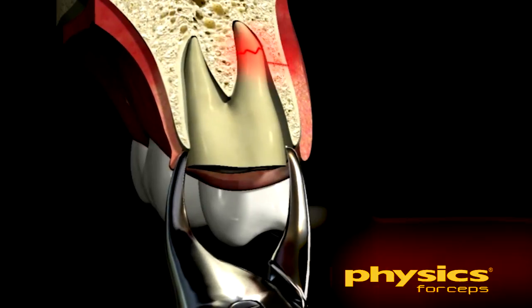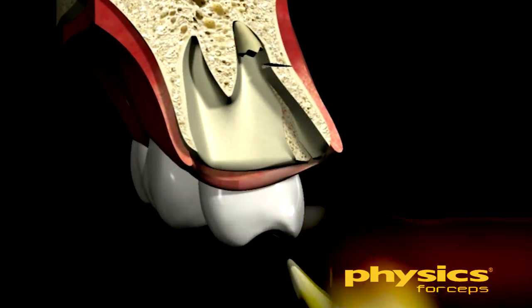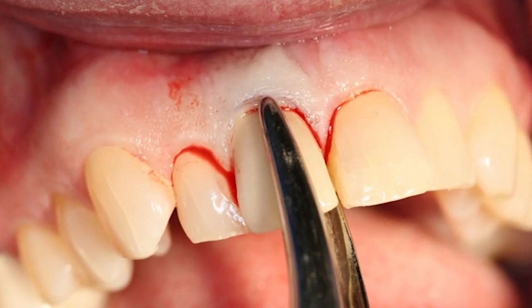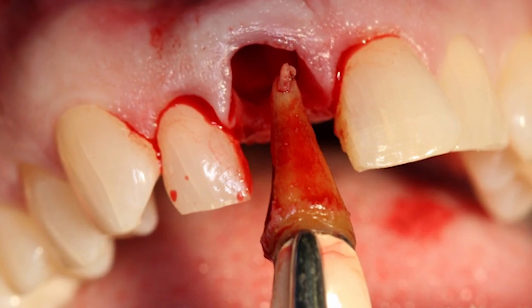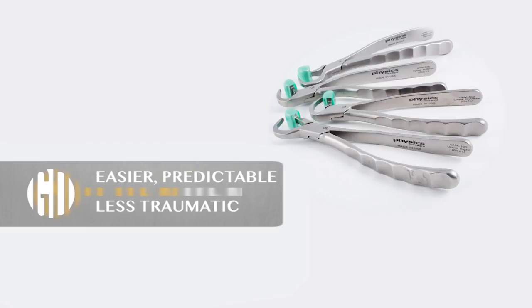It's important to note that once the tooth is elevated coronally out of the socket, continued rotation of the tooth buccally or lingually is not advised, to prevent damage to the buccal or lingual plate. At that point, a rotational or traditional forcep can be used to quickly and easily remove the loosened tooth. The physics forceps make the extraction of any tooth easier, more predictable, and less traumatic for patient and practitioner alike.